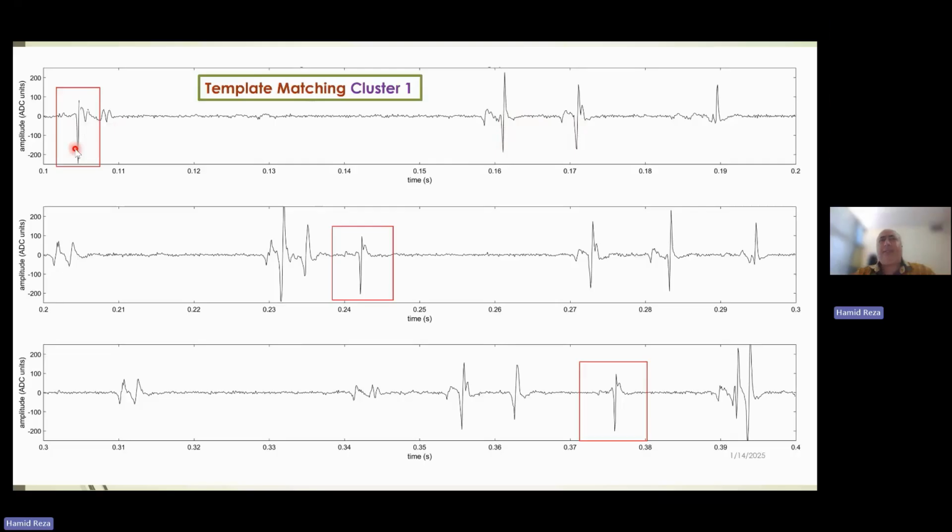By looking at the signal, we get various techniques, and we implement them in our manual or automatic decomposition. First of all, we say, okay, let's focus on those that have higher amplitude, because I might be able to see those with lower amplitude, but it's tricky.